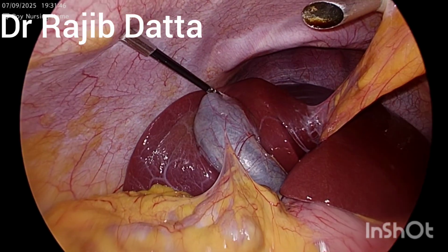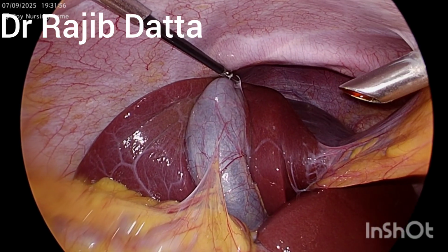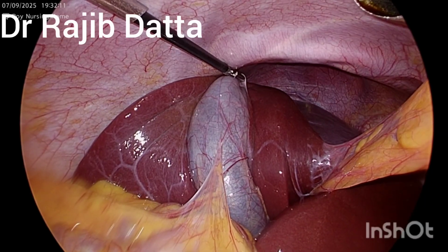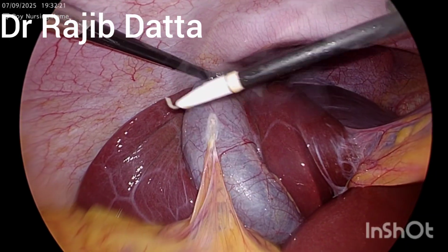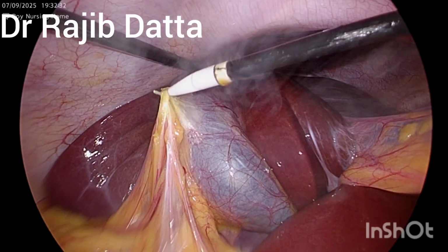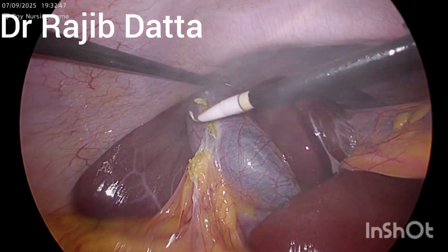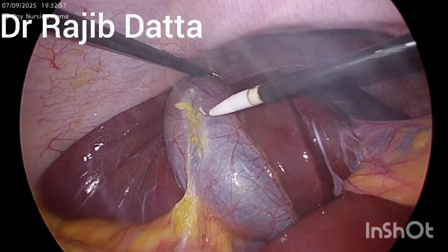You can appreciate that due to the recurrent infection there are adhesions of the omentum and the undersurface of the liver. There is grade 1 fatty infiltration or hepatic steatosis present. And now the hook is introduced, and adhesiolysis is our first job that is going on, and we stick to the embryonic plane, which is usually an avascular one, so that the lateral thermal damage and the gut injury can be minimized. So first job is adhesiolysis.